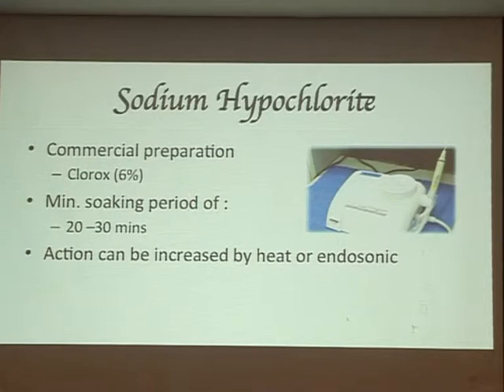You need a minimum soaking time of 20 to 30 minutes. If your appointment is too fast, faster than 15 minutes, you do not have enough time. You need more time to soak and to dissolve the organic tissue. That's very important. So your appointment should be at least 30 minutes to 1 hour.